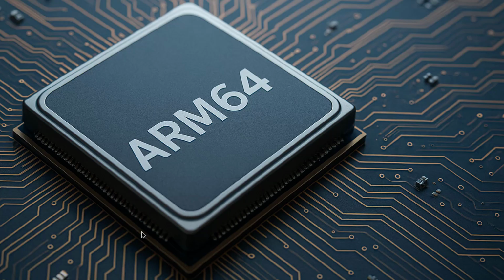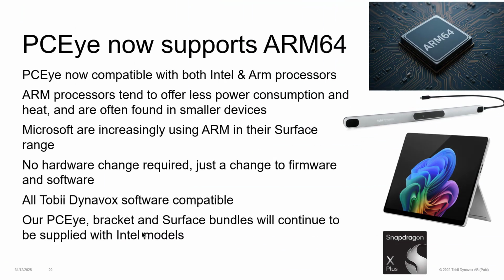Another piece of news that I know a lot of people were asking for is that the PCEye is now compatible with ARM64 processors. This is big news. So ARM processors tend to offer less power consumption and heat and are often found in smaller devices. And Microsoft are increasingly using ARM in their Surface range. So it was that the lower price Surface tablets would come with ARM processors, and the Microsoft Surface for Business would come with the Intel processors. And until recently, you would have had to have chosen the Microsoft Surface for Business.